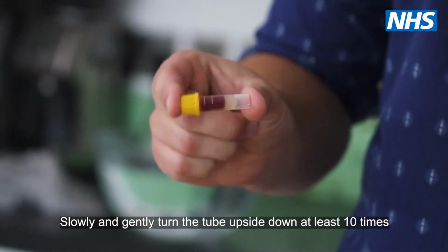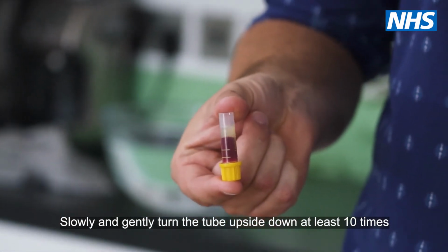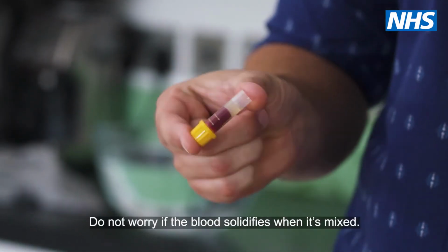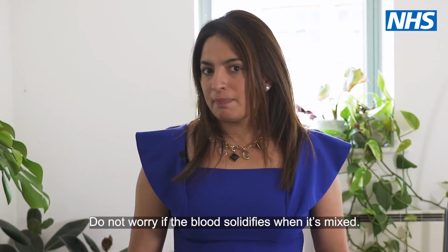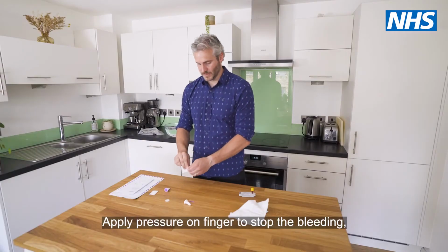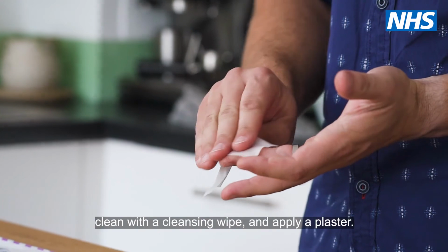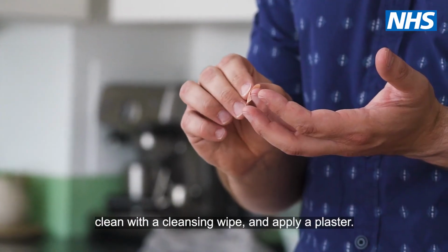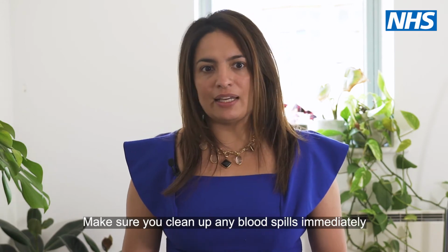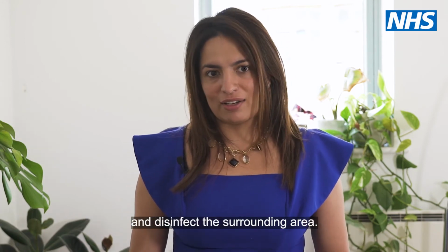Slowly and gently turn the tube upside down at least 10 times. Make sure not to shake it. Do not worry if the blood solidifies when it's mixed. This is supposed to happen. Apply pressure on your finger to stop the bleeding. Clean with a cleaning wipe and apply a plaster. Make sure you clean up any blood spills immediately and disinfect the surrounding area.